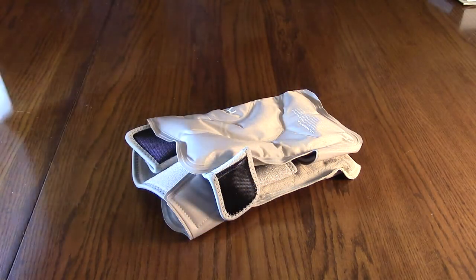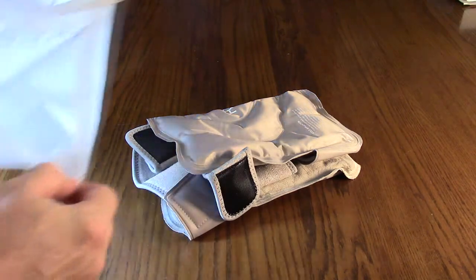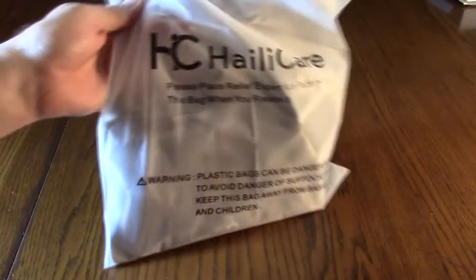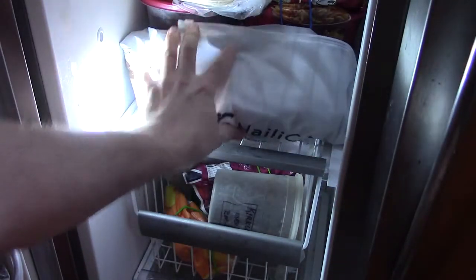The first thing I'm going to try is to take the product, put it in the included bag, seal it, and put it in my freezer for a couple of hours. Here I'm adding it to my freezer and we're going to let it chill for a couple of hours.